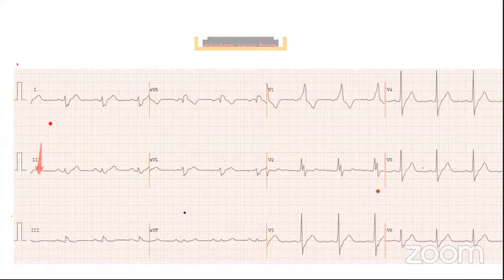And next we see the intervals. Good. The RR intervals appear to be constant. And the QT interval appears to be a little less than half of the RR interval, as you had told. So that is normal. Good. And the PR interval should be less than 5 small boxes, which is less. Good. And next, chamber enlargement we're not seeing now. And then we see the waves.